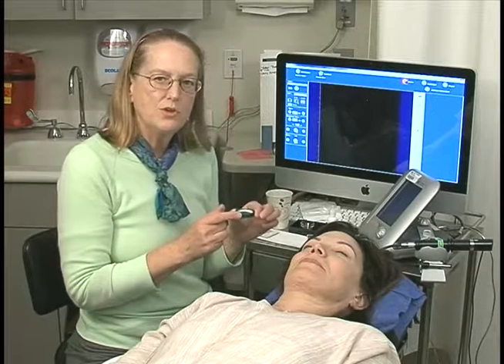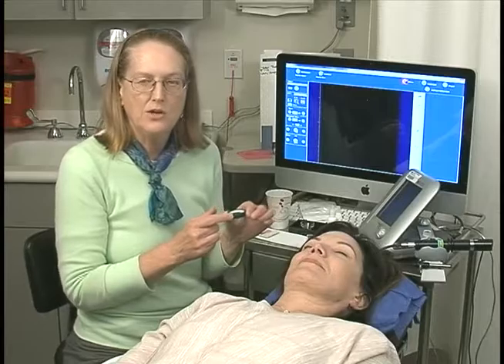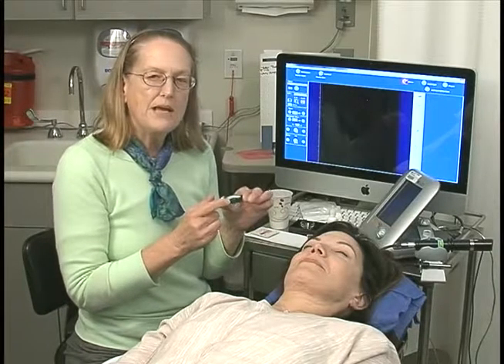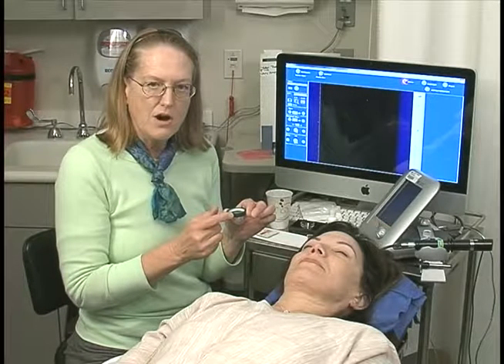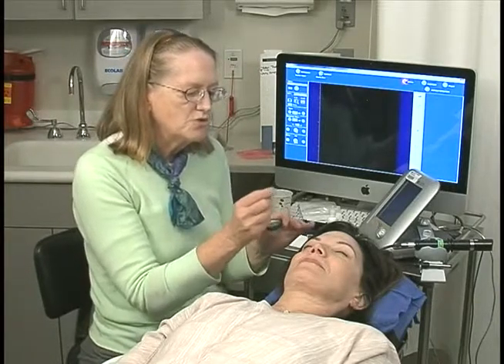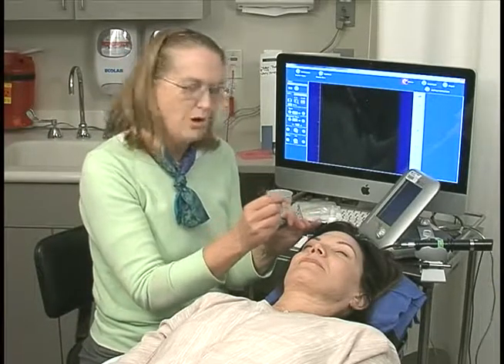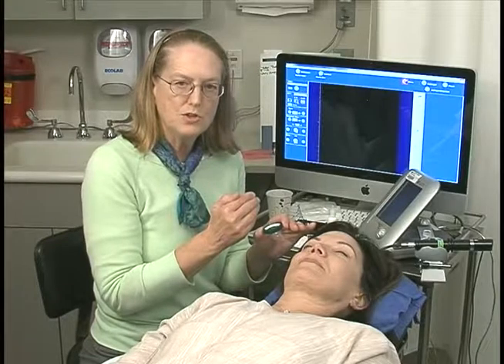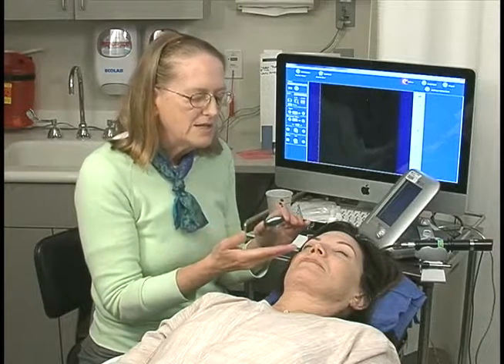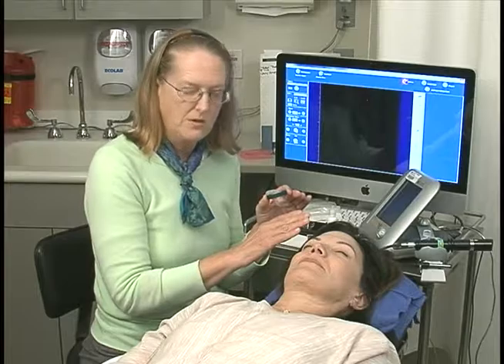Because of the high frequency we're using — in this case 50 megahertz for UBM — it doesn't penetrate very far into the eye. So we are going to be imaging directly under the probe, unlike our posterior segment B-scan where I would place the probe inferiorly to look superiorly.